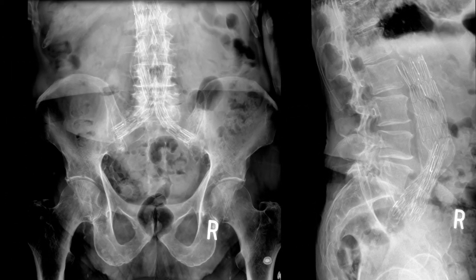In the case of endovascular surgical repair of an abdominal aortic or common iliac artery rupture, stents can be placed. This is a good example of one of those stents visible on X-ray.